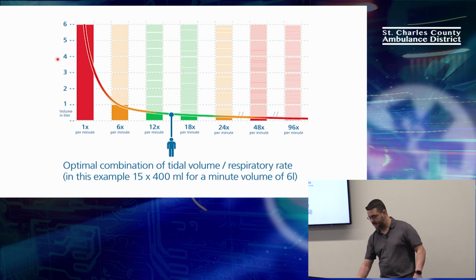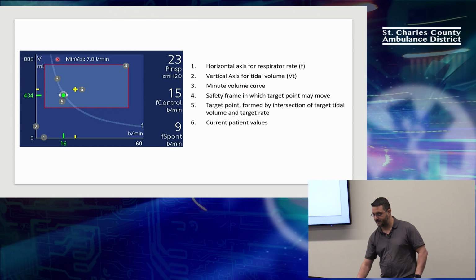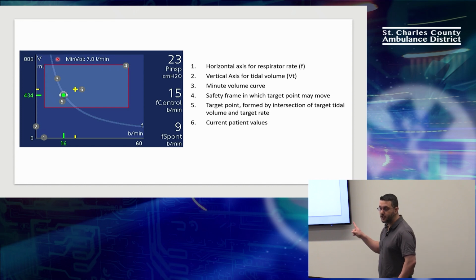So you're explaining the ASV graph that we're going to see. Yes. Just explaining it, that's it, nothing else. I'm just explaining the graph. This is the graph in real life. Have you guys seen this graph before? Is this the first time you guys have seen this? No, we've seen it. Okay. This is totally different than the graphs I was showing you. This is doing their own thing. This is Hamilton's own thing.